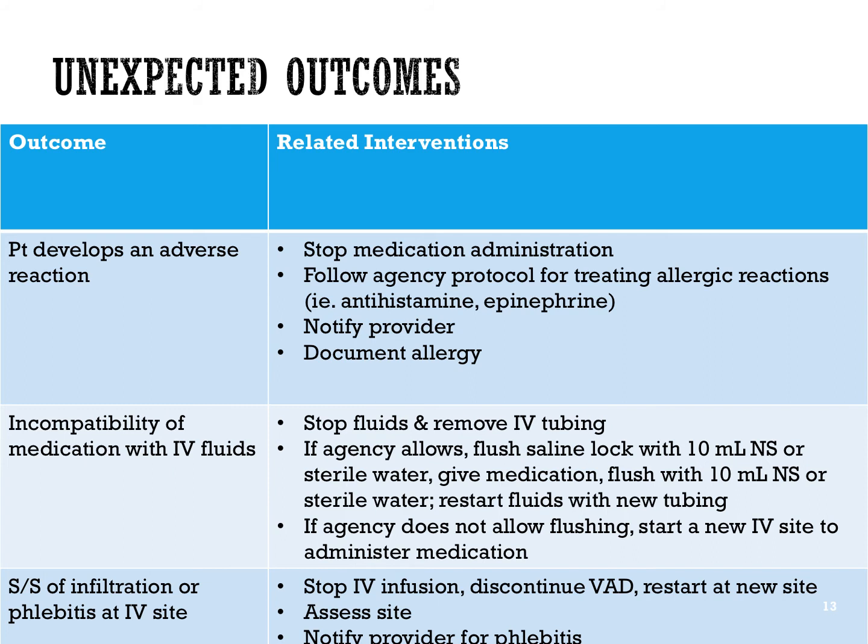If the agency doesn't allow flushing for incompatible fluids and medications, you will need to start a new IV site somewhere else in order to administer the medications and restart the fluids.